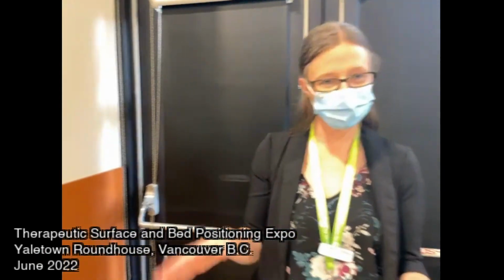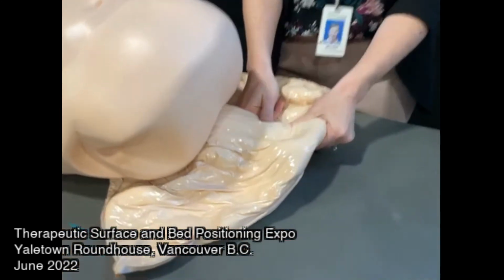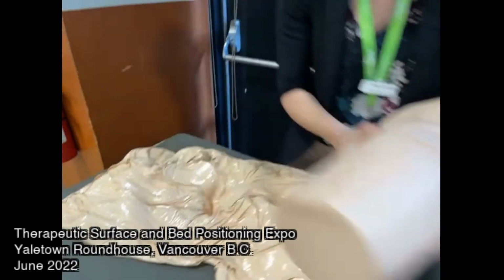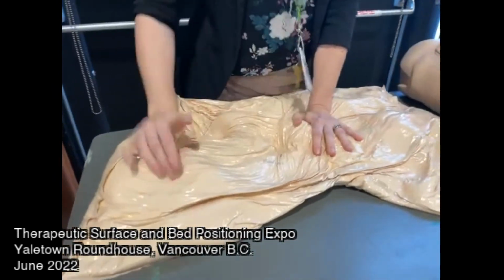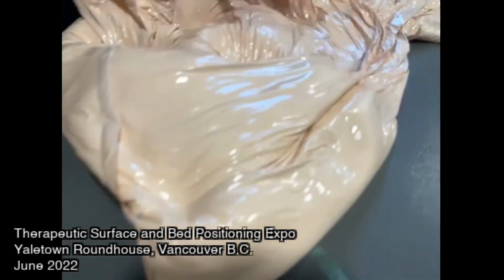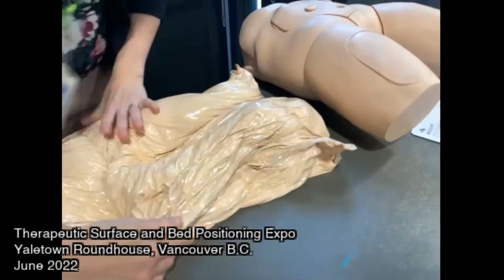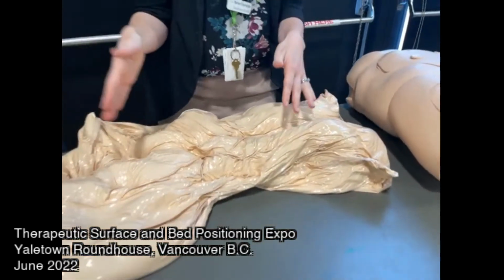Hi everyone. So thankfully we have this thing here, which is called a Z-Flow Fluidized Positioner. This is filled with gel, and there are some little tiny beads in there. When you need to reposition somebody, you're going to squish this, and then let's say they have a pressure injury.